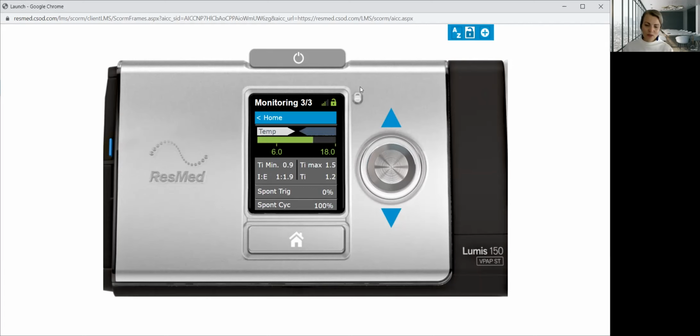This is very much what I would like to show you using this simulator.